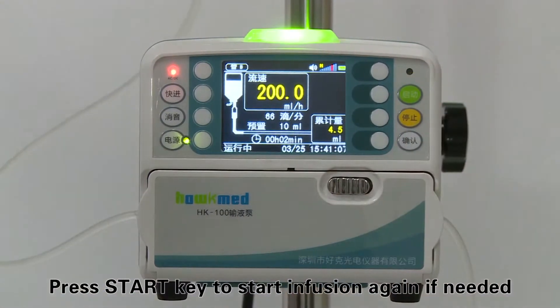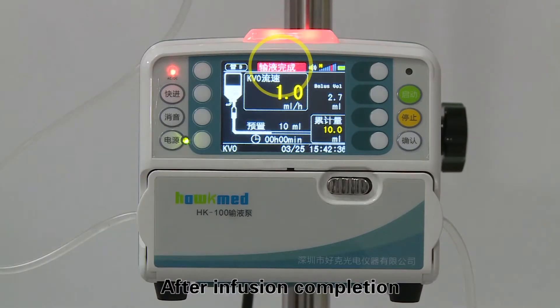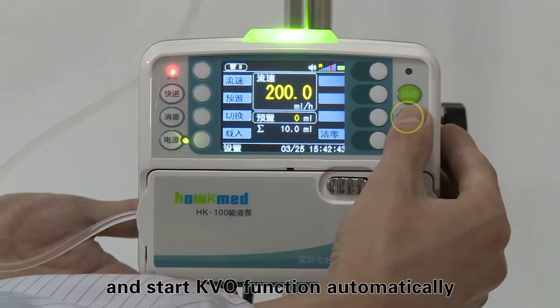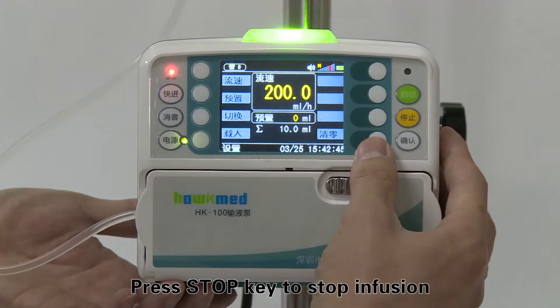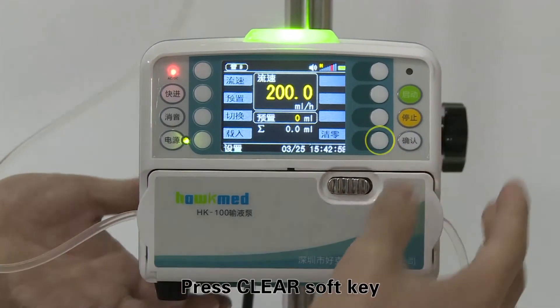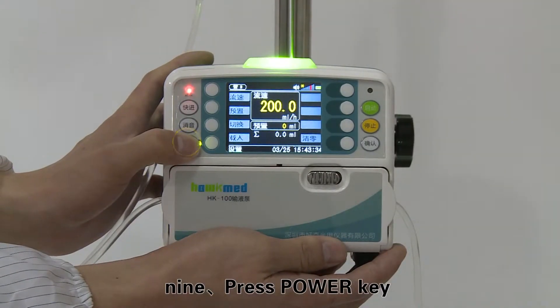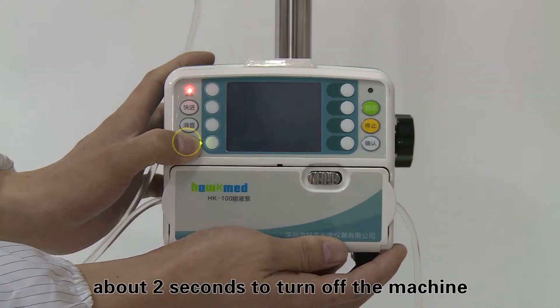After infusion completion, the machine will give an over alarm and start the KVO function automatically. Press the stop key to stop infusion, then press the clear soft key to clear the accumulative volume. Step nine: press the power key for about two seconds to turn off the machine. Make calibration and verification when changing to a new brand of infusion set.